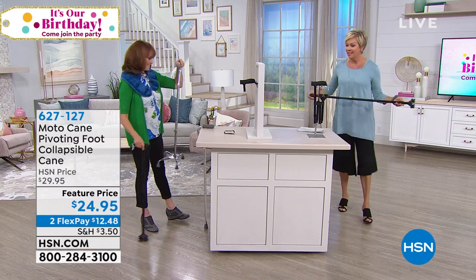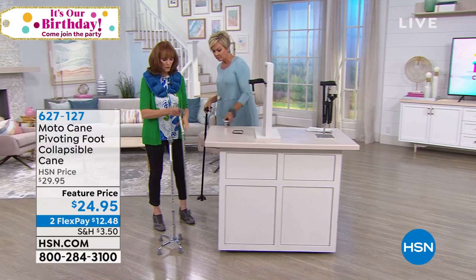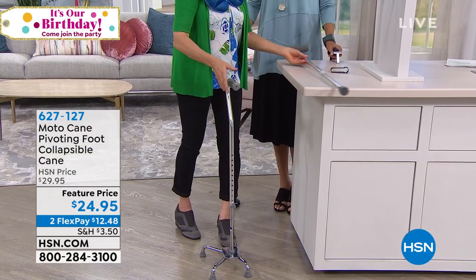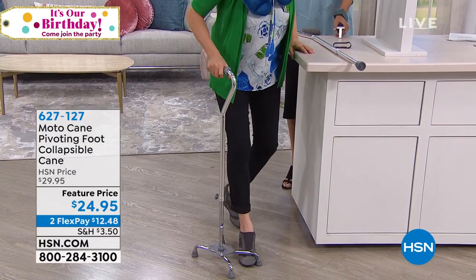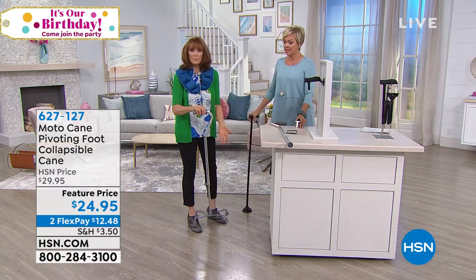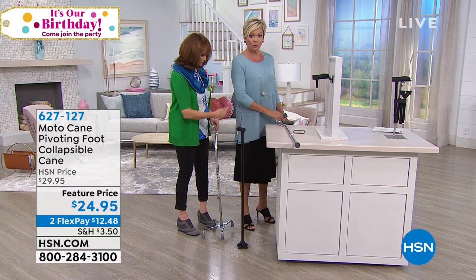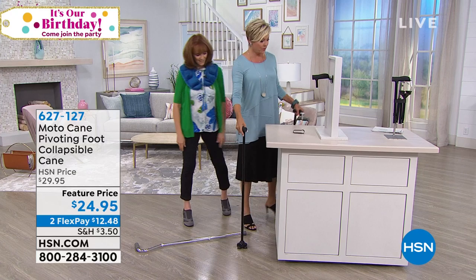Most canes — what do you do with them? I have two that don't collapse. This one has only one point of contact, which can be very scary with mobility and disability problems. And this one has four points of contact, but you'll trip over it as you take your next step — so it can actually be a hazard. It doesn't collapse, so where does it go on the plane or in the car? This one stands up on its own; that one won't.